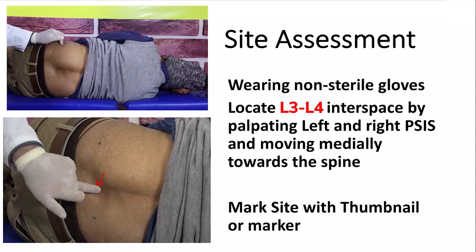You can mark the site with a thumbnail. You can use maybe the back side of a needle cover and put an indentation on the skin, or you can use a marker to highlight the L3, L4 site.